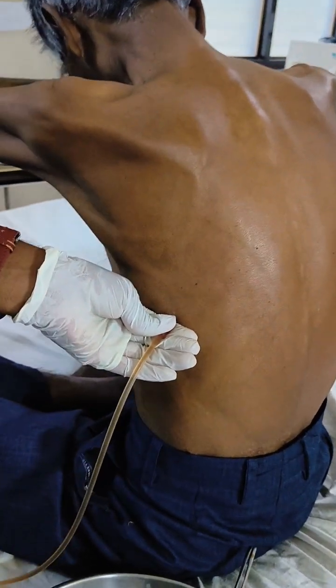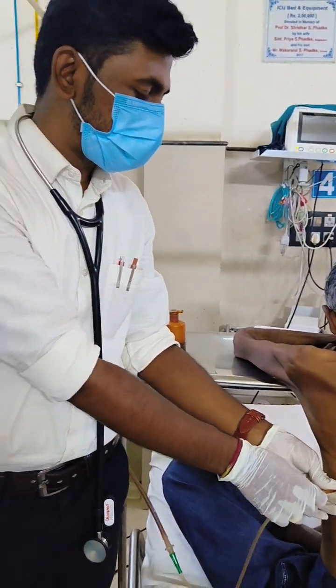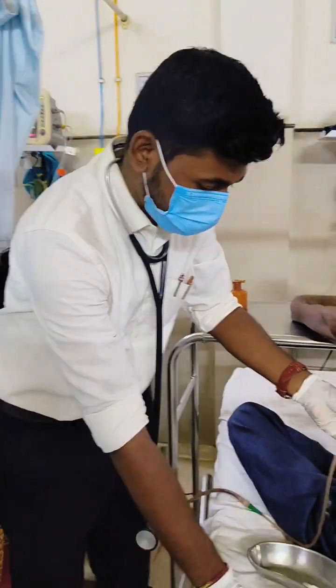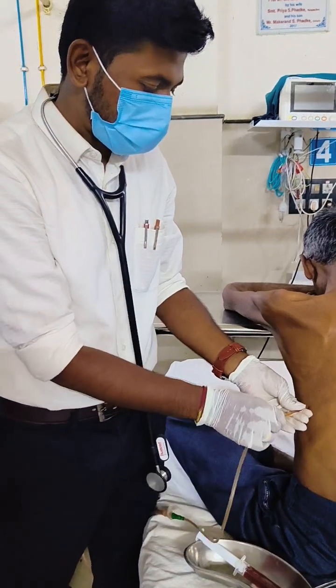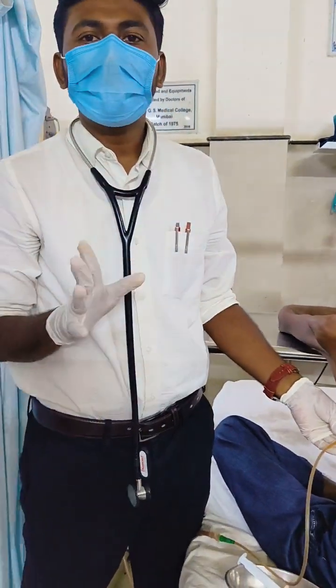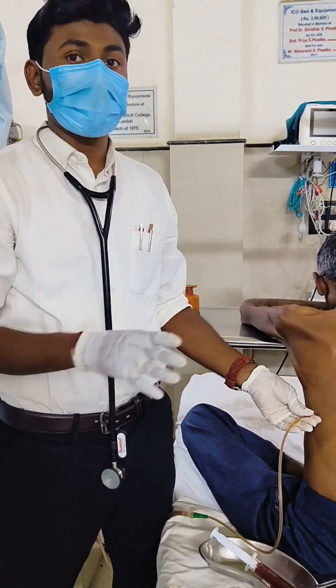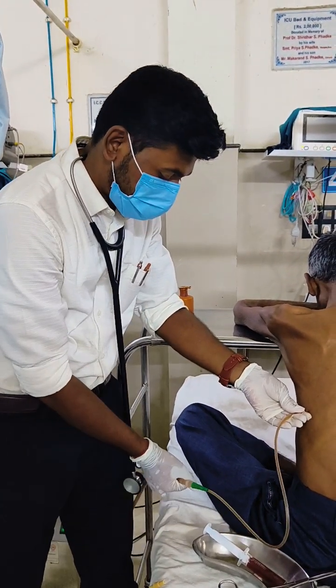We are tapping now because there are some complications of tapping. So there are complications of tapping, like if the patient is a chronic smoker. Now there is a dark color fluid. It is a very warm fluid.